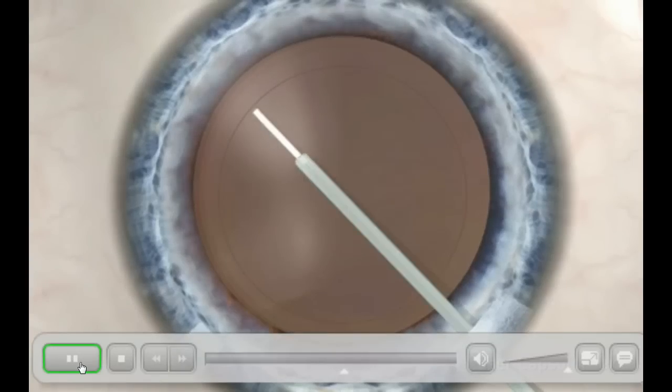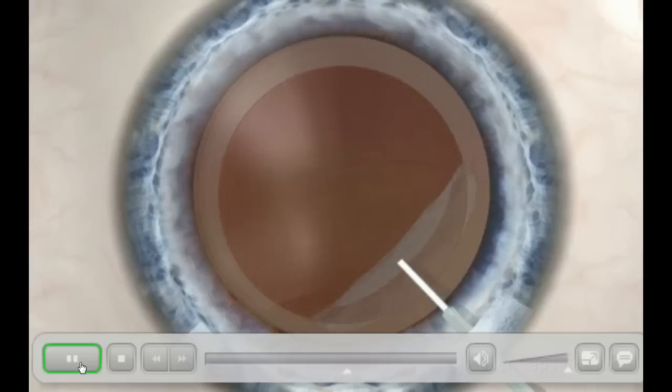The consistently precise laser-controlled capsulorhexis contributes to better lens positioning and therefore more predictable visual results, which is especially important with premium IOLs.